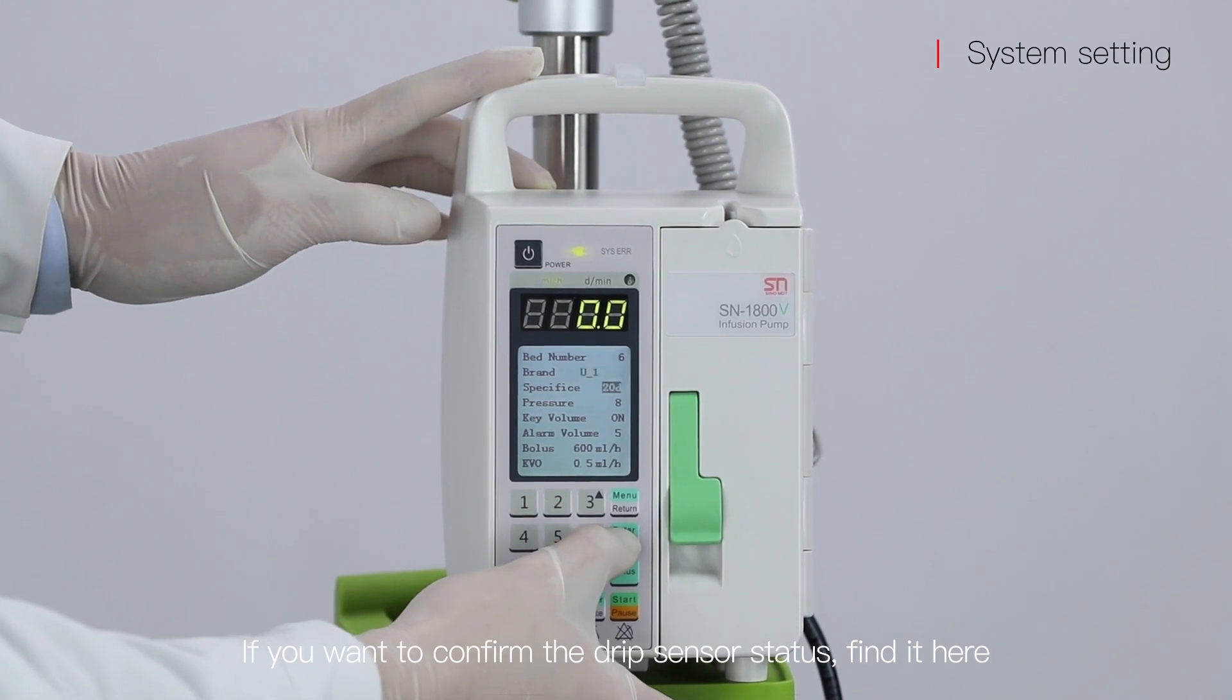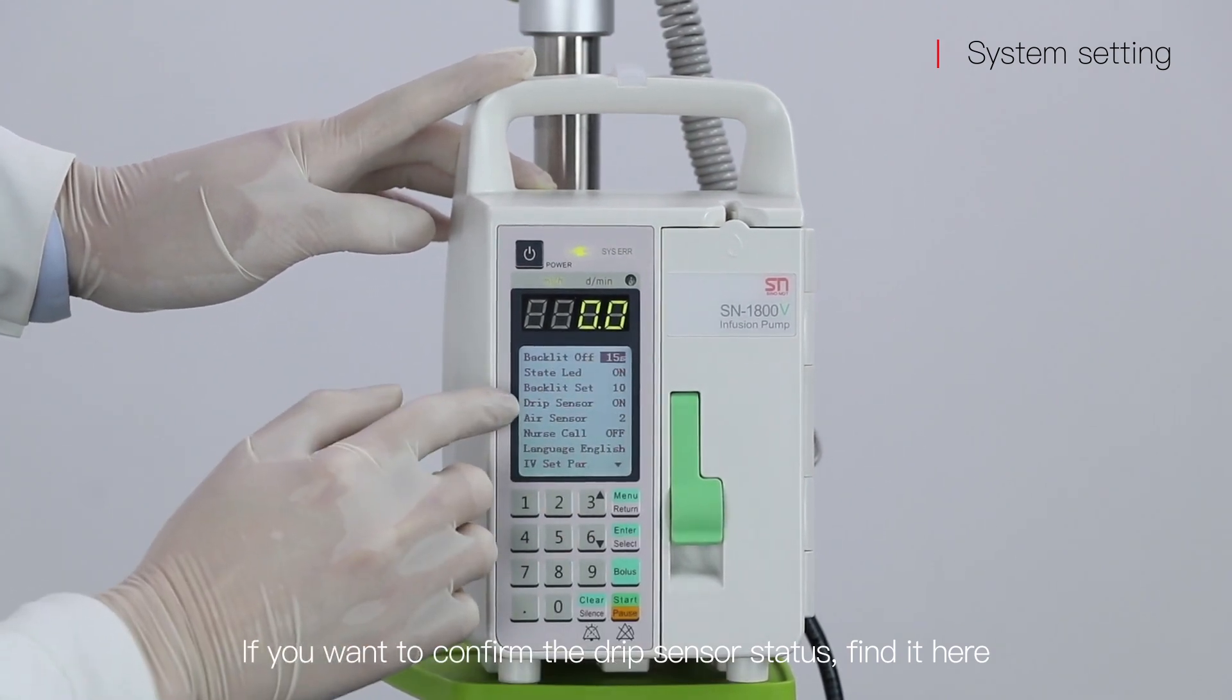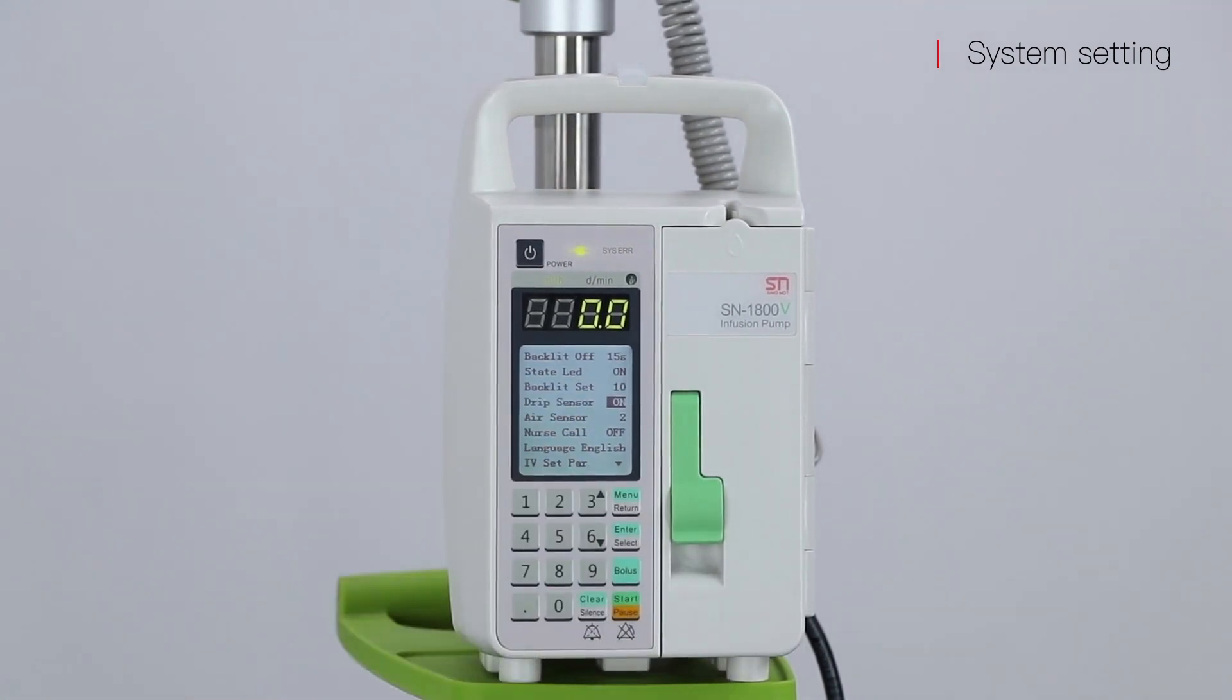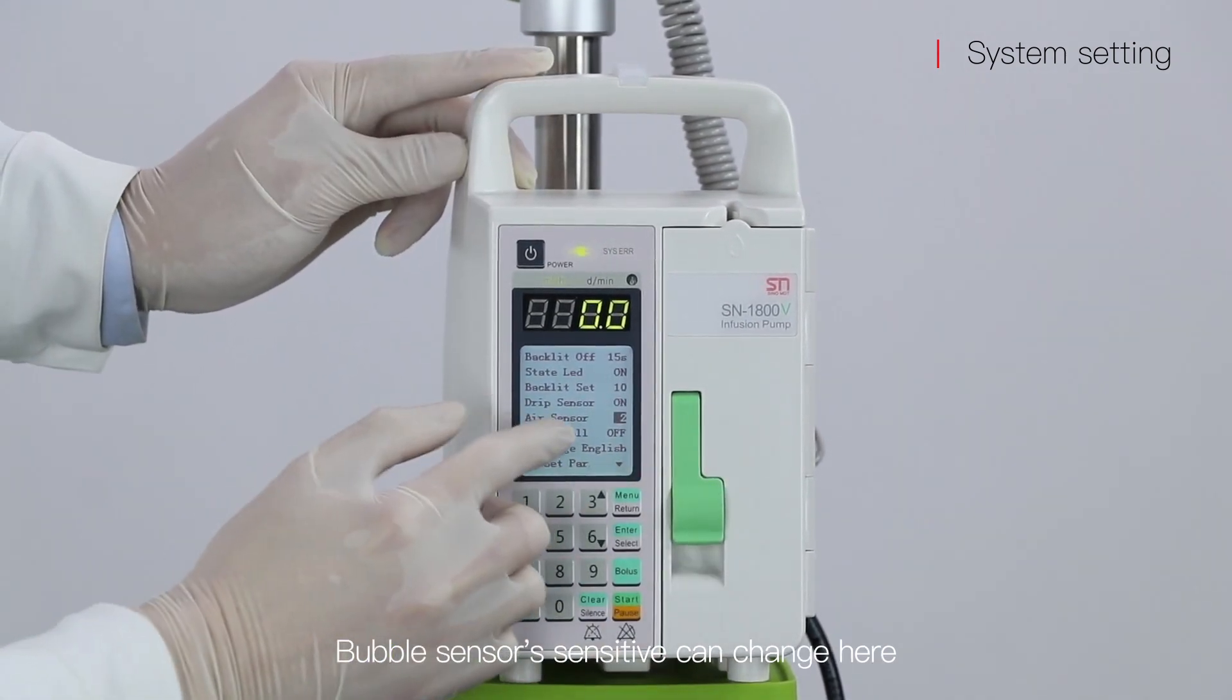If you want to confirm the drip sensor status, find it here. Make sure it is on when you use drip mode. Bubble sensor sensitivity can be changed here.